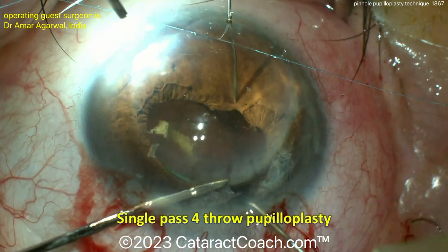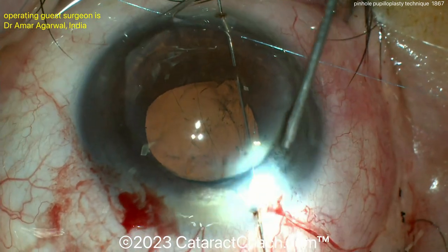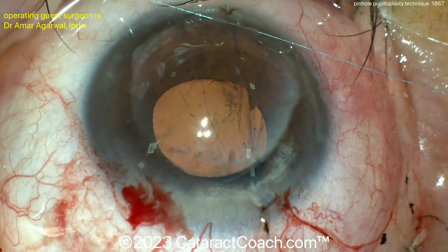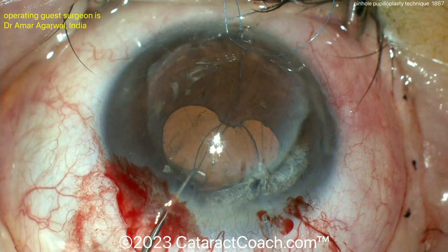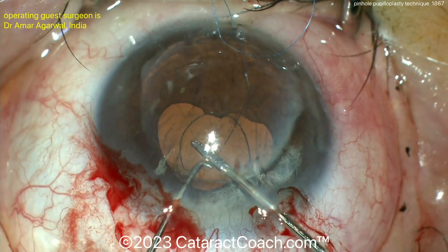This is the single-pass four-throw pupilloplasty technique by Dr. Agarwal. As you see, passing that 10-0 prolene through, you're going to close the pupil entirely and then use the vitrector to create a central small pupil.